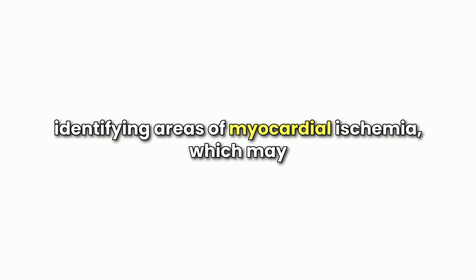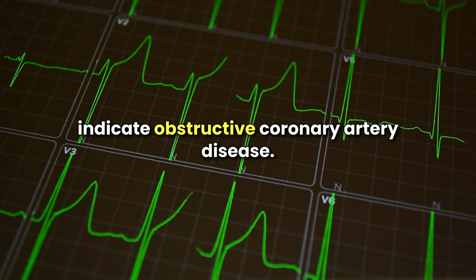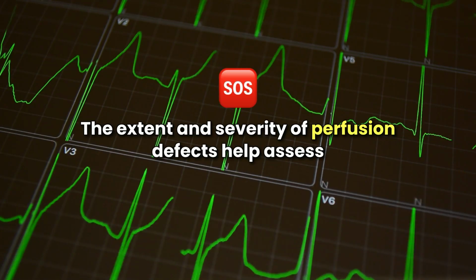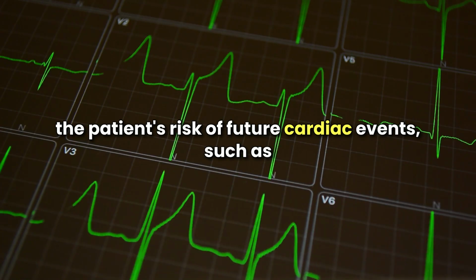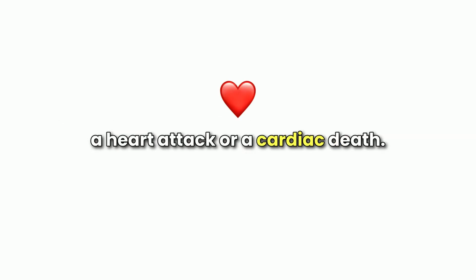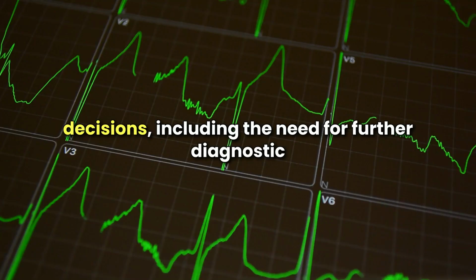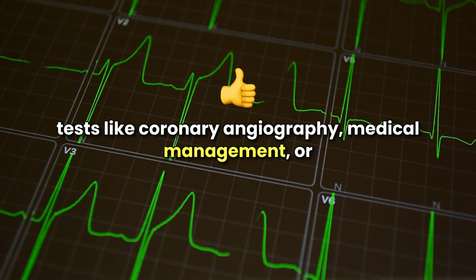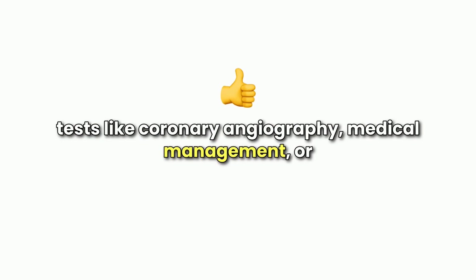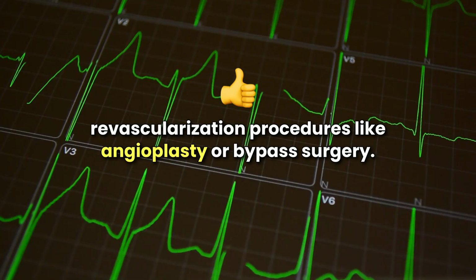The primary outcome of SPECT MPI is identifying areas of myocardial ischemia, which may indicate obstructive coronary artery disease. The extent and severity of perfusion defects help assess the patient's risk of future cardiac events, such as a heart attack or cardiac death. The results from SPECT MPI guide clinical decisions, including the need for further diagnostic tests like coronary angiography, medical management, or revascularization procedures like angioplasty or bypass surgery.